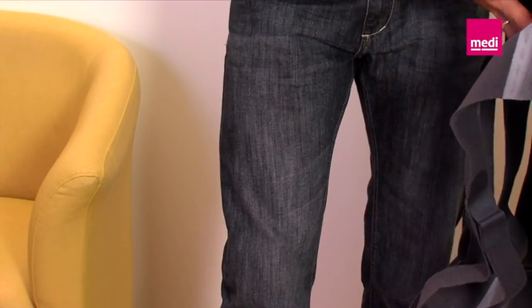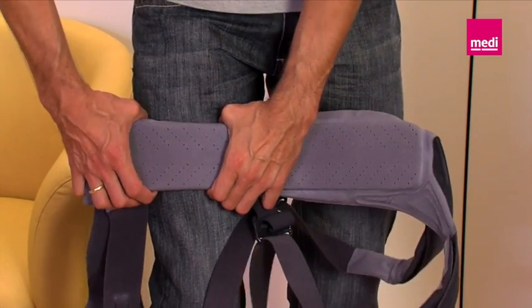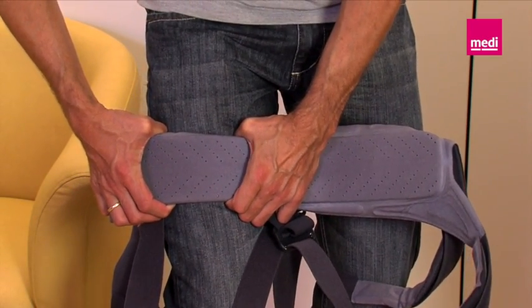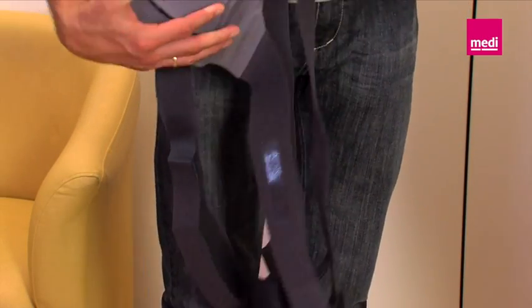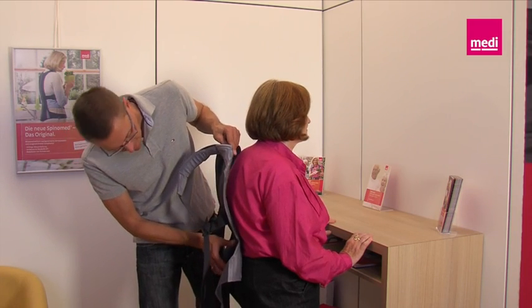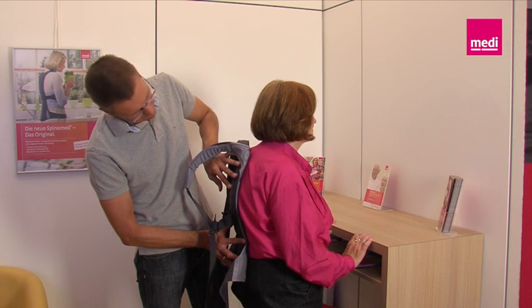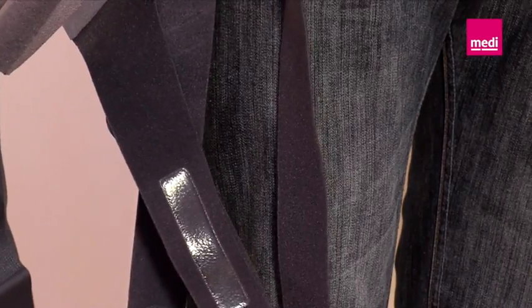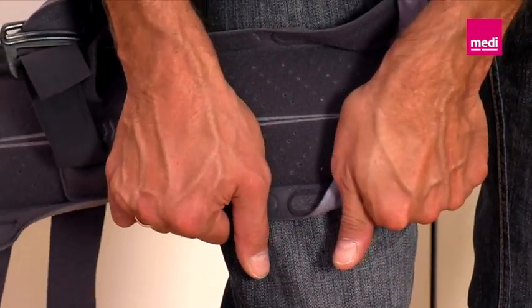Setting the back rod. Now the brace will be set, starting in the lumbar area. The brace is set from bottom to top, following the curvature of the back. As you can see, setting can be carried out without any tools. It's important that you always apply the splint to the marking point to check alignment. Now set the splint step by step in the direction of C7 until it traces the entire spine.